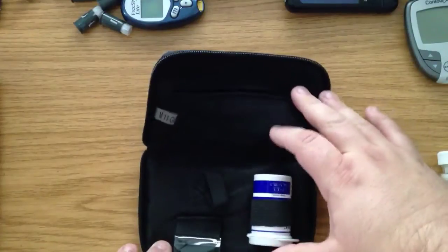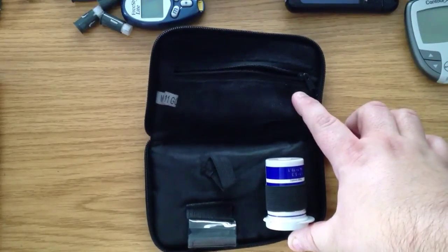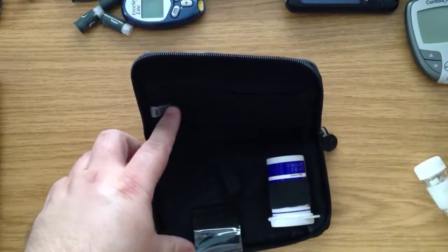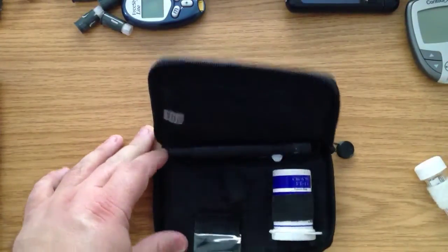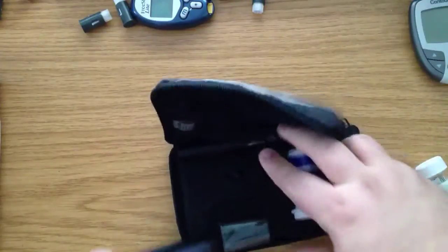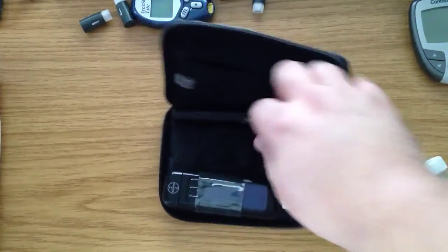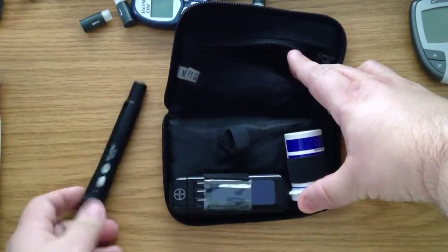This is one from Bayer, and obviously they make it to actually fit the test meter that you're going to use from them. So if you wanted to mix and match, like I use a Fast Clicks pen, there's really nowhere to secure it. There is a pocket in here where you can put lancet drums or lancets, but likewise if you want to change meter, this is for the Contour Next USB. The finger pricker is just going to sit there very loosely and slide out when you try to open it.